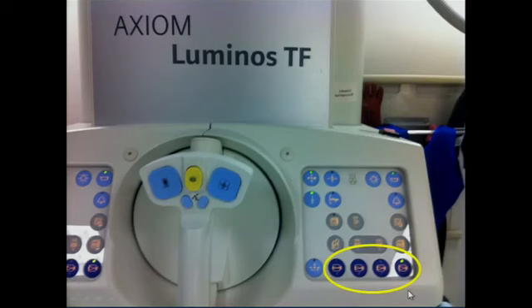And here are these magnification modes. And I tell you, really use them sparingly, especially on old II systems. Because on old II systems, if you magnify down to a smaller region, your minification gain is reduced, right? You now have a smaller area being projected onto the II, so there's not as much minification gain. And so therefore, the amount of mA is boosted by the automatic exposure control to keep the brightness of the image about the same. That isn't quite as bad an effect in digital imaging systems, where you can digitally boost the brightness of the image instead of having to do that. But you do pay the price of the image being a bit noisier there.